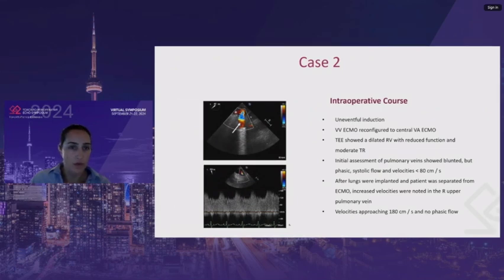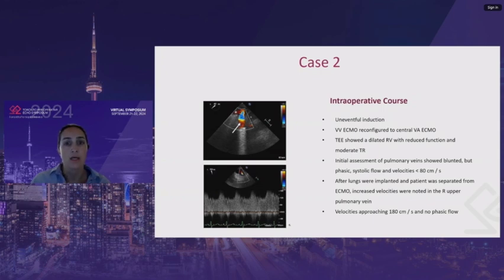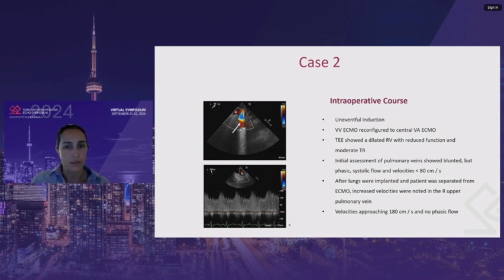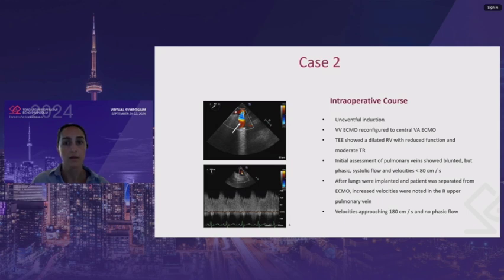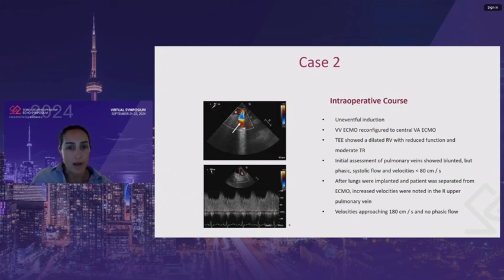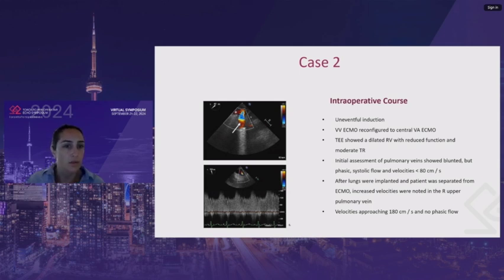Intraoperatively, there was uneventful induction. VV ECMO was reconfigured to VA ECMO. TEE showed a dilated RV with reduced function and moderate tricuspid regurgitation. The initial assessment of the pulmonary veins showed blunted but phasic systolic flow with velocities of less than 80 centimeters per second, which is acceptable given the history. After the lungs were implanted and the patient was separated from ECMO, increased velocities were noted in the right upper pulmonary vein with turbulent flow. The velocities were approaching 180 centimeters per second with no phasic flow.